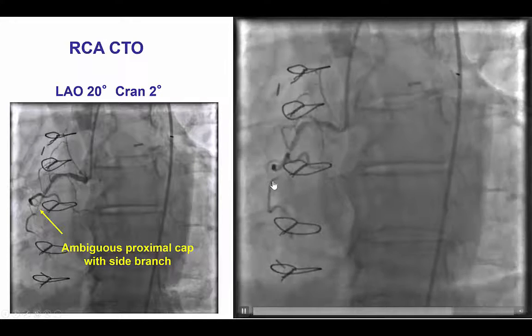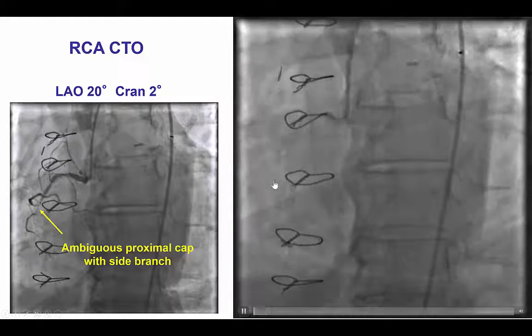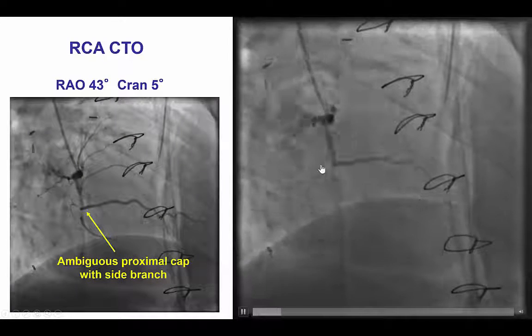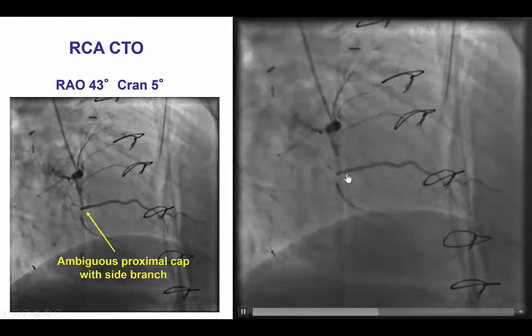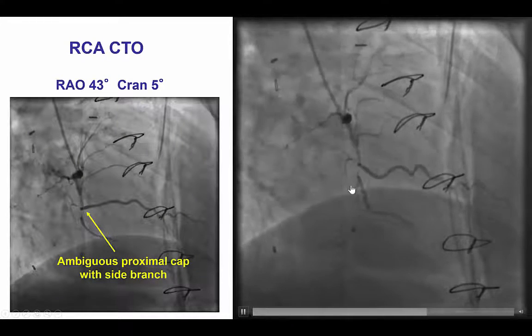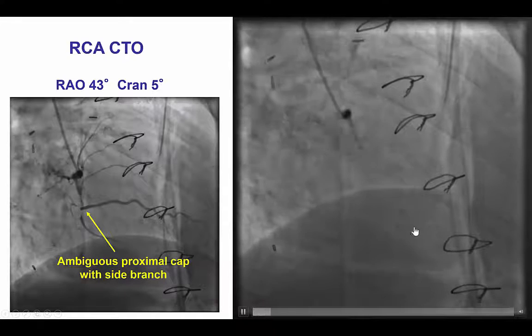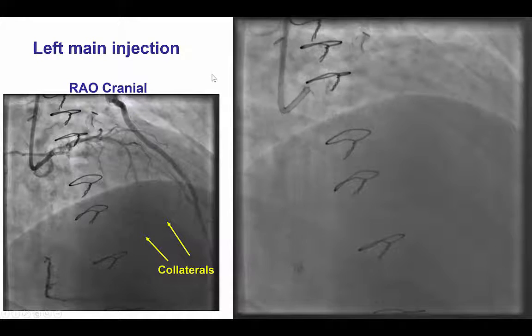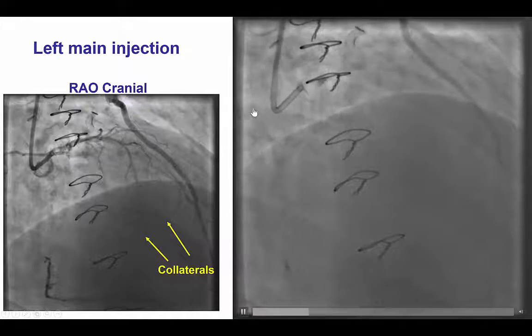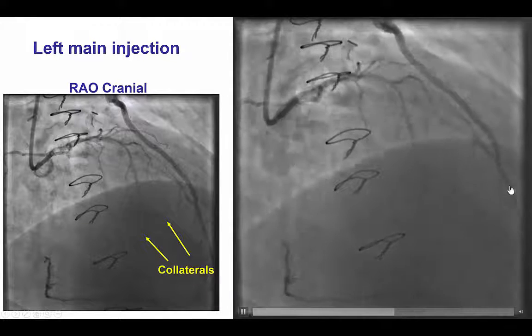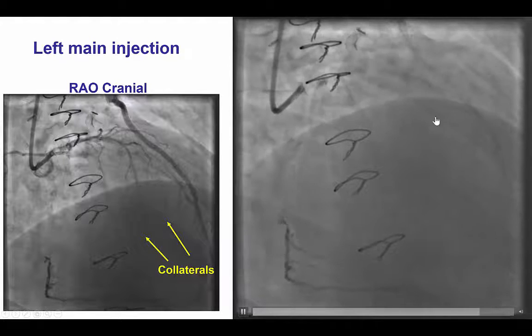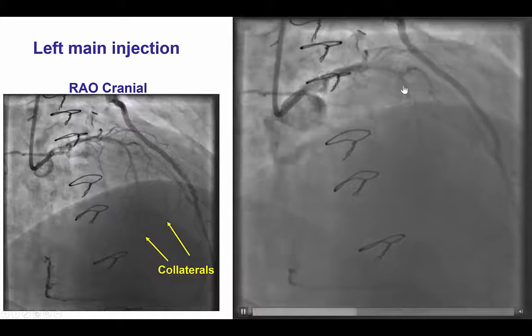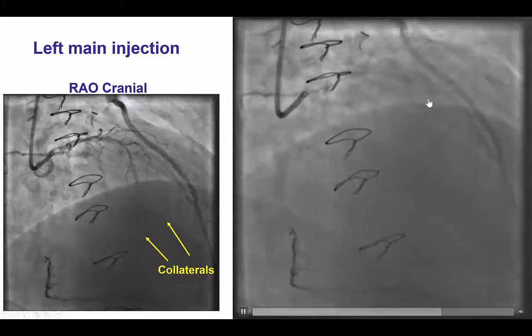The mid-RCA was occluded at the takeoff of an acute marginal branch. This was seen in the RAO view, in which the vessel ends essentially at the acute marginal takeoff, with severe calcification before and after the occlusion. The mid-LAD was filling via LIMA graft, and there was also antegrade flow from the left main, with significant disease in the LAD.